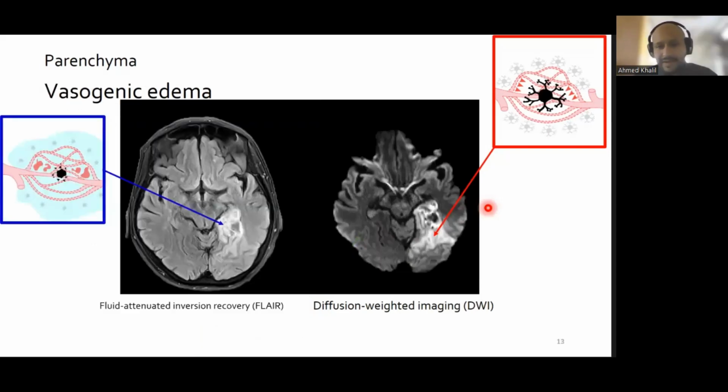And the other side of that is that using FLAIR, so fluid attenuated inversion recovery sequences, we're able to pick up on vasogenic edema, which, remember, happens at least a couple of hours after the onset of cytotoxic edema. Together, those two sequences really help us tell how old the stroke is. Is this a stroke that just happened within the last half an hour, or is it a stroke that's been going on for 6-7 hours? So that's one way that we're able to tease those things apart.